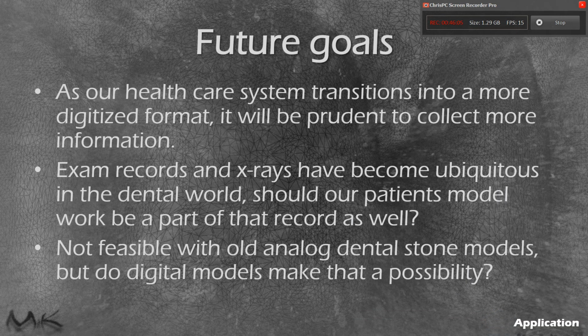So as we move forward in our dental practices, it's not just the fact that that 3D printer is going to provide us a basic product with the benefit of seeing that tangible cost as a reduced lab bill, but what that's also going to allow us to do is take a scan or a model and digitize that model to attach it to the patient's x-rays or attach it to the patient's patient management system. So I think that digital models really makes this a possibility.